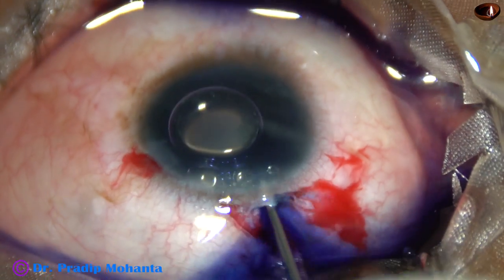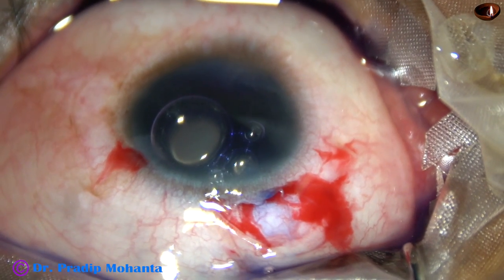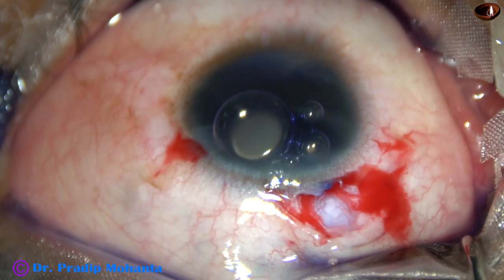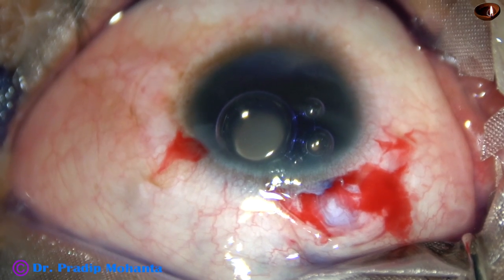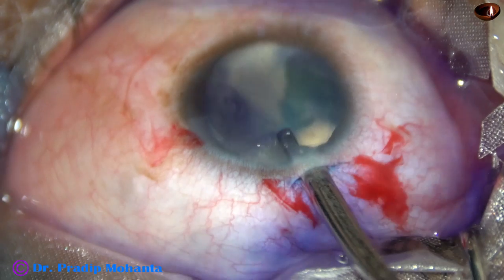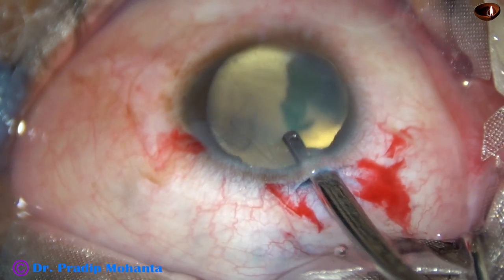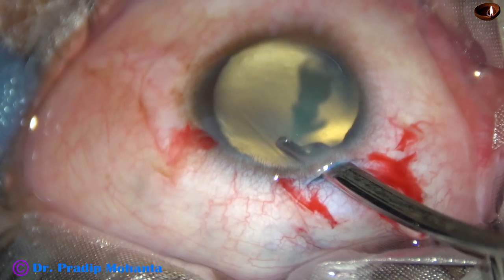Now I want to stain the anterior capsule with trypan blue dye to get some contrast. In this case, we are getting a white reflex because of coloboma choroid. The anterior capsule has been stained with trypan blue dye.